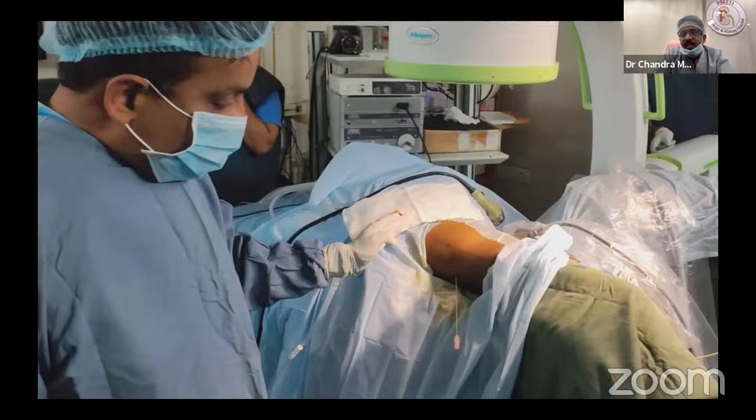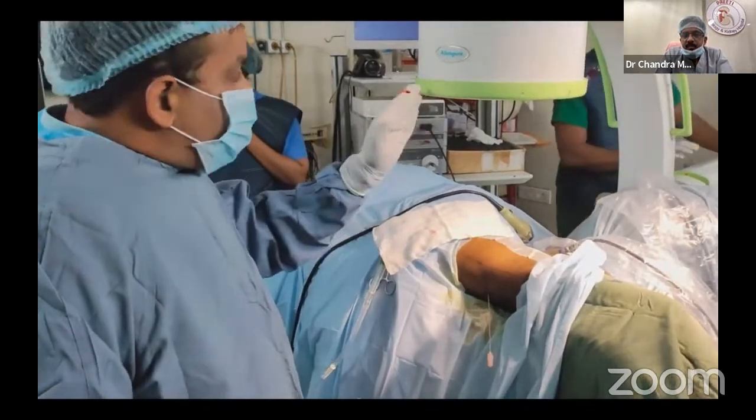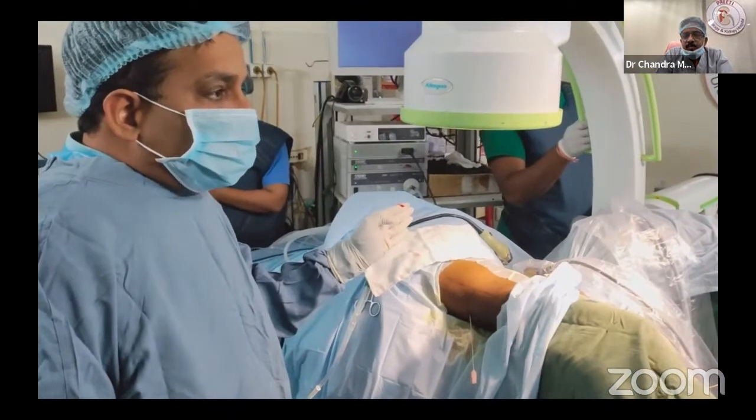So after confirmation in both angles that it is there, you can take out the needle and see. The third important point I am telling is to move the needle wherever the maximum movement and kidney calyx deformity happens, then you are 100% sure that you are entering the kidney. That I am showing here. I will ask for respiration to stop. I will shift 30 degrees to the head end. What will happen with 30 degrees head end?